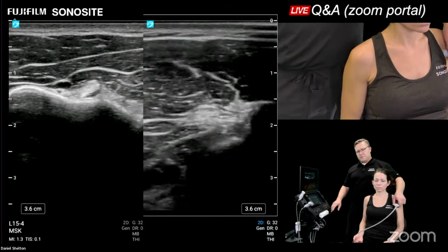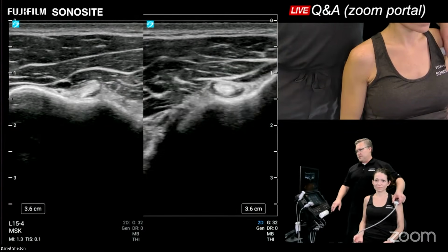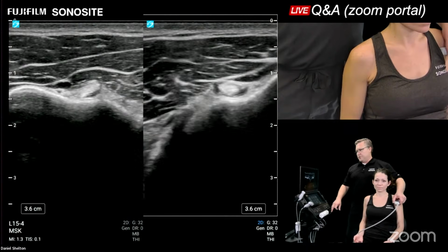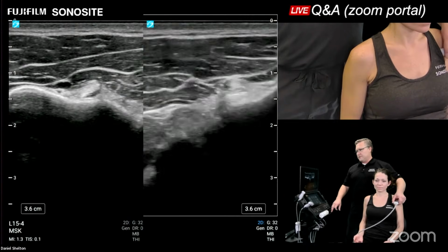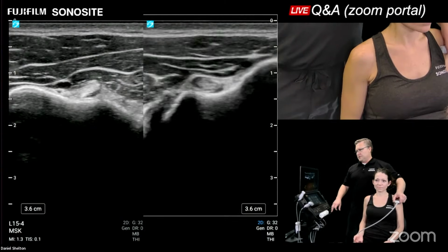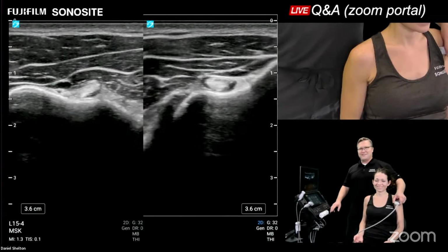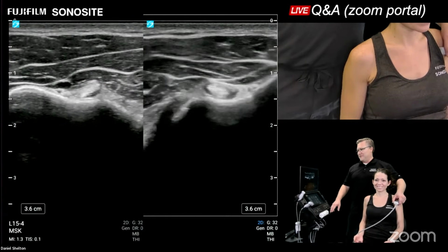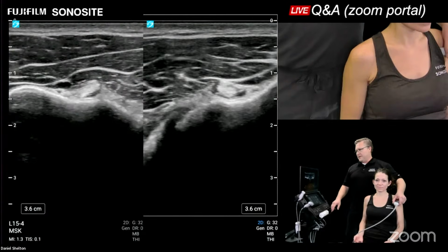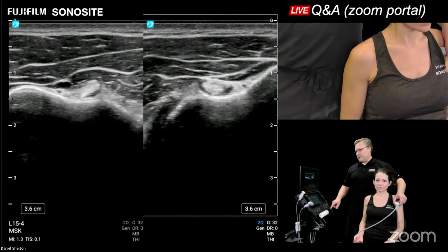We do have an effusion over here because our model had surgery about a year ago on this particular shoulder. And ever since her surgery, she has had a little bit of a halo sign around the biceps because we've got joint disruptions and anchors and cool stuff down in the joint, which could be a whole webinar on its own. But here's the difference in saying that this patient's left side shoulder has a biceps tendon effusion and the right side does not.